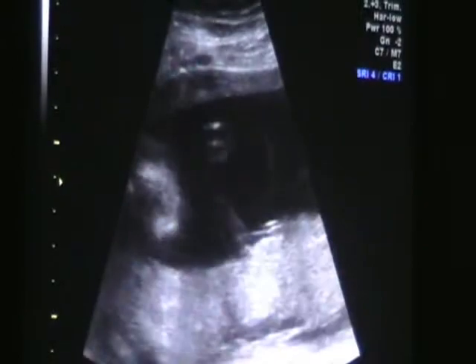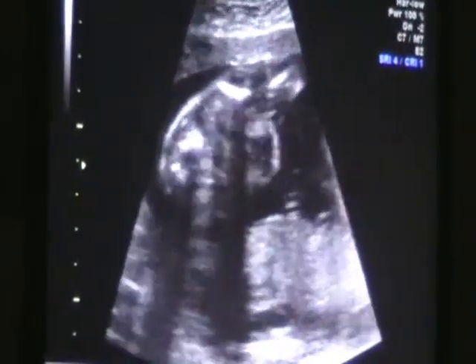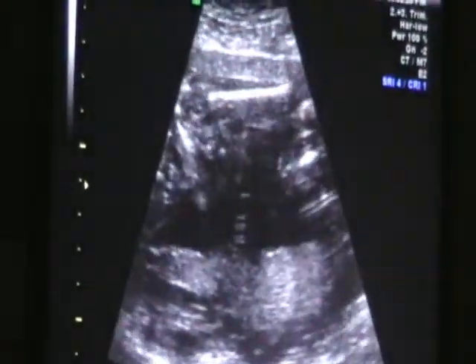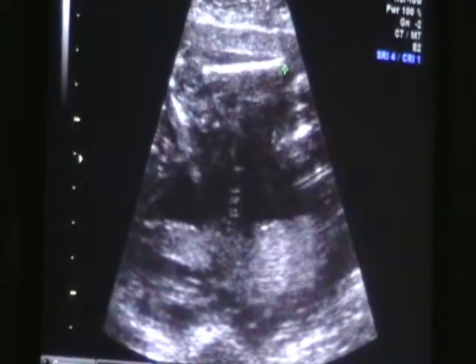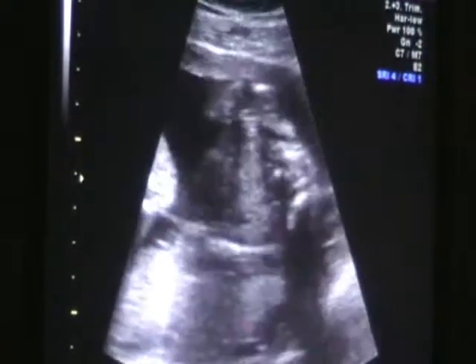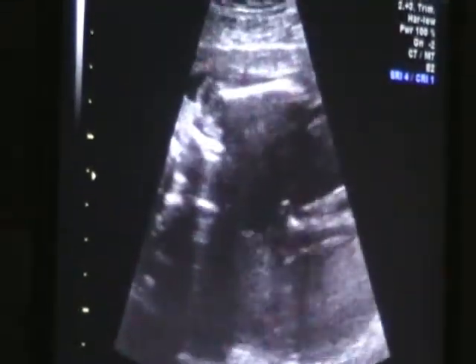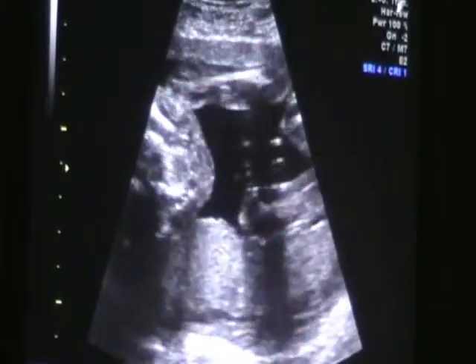Let's move on down and look at the upper arm or belly, whichever she'll show me first. Here's her arm. This is just about an elbow here, so elbow up to shoulder. I'll show you that again. There's her chest. There's her arm, her shoulder. Those are legs that are down below here. She's curled in a ball.